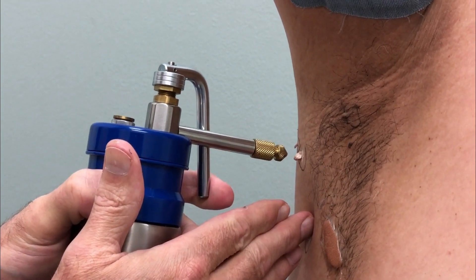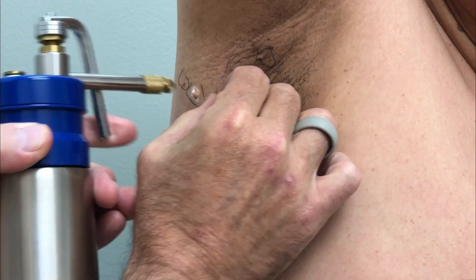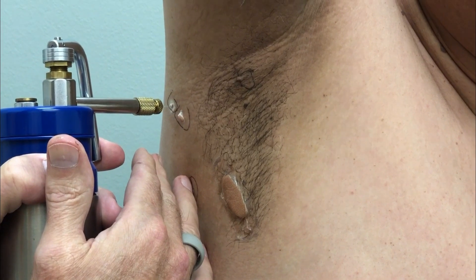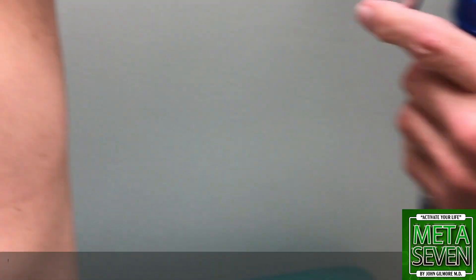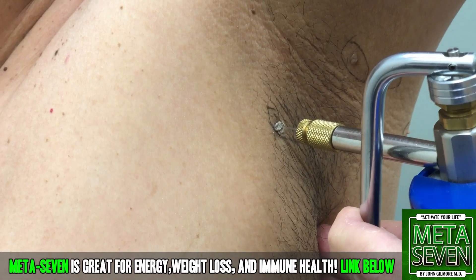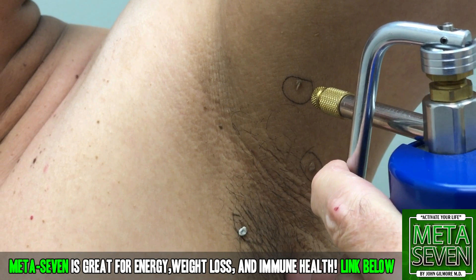This is a little bigger one — the larger ones you have to be sure you get the base of the stalk. You're doing good. Let me switch sides now. Was it as cold as you thought it was going to be? Oh no, we used it all up.